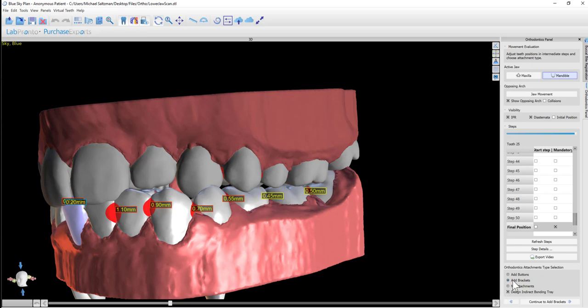Or the indirect bonding tray can be designed and exported directly from the software. We're going to select the option to both add the brackets and design the indirect bonding tray, and then press the button to continue to add brackets.